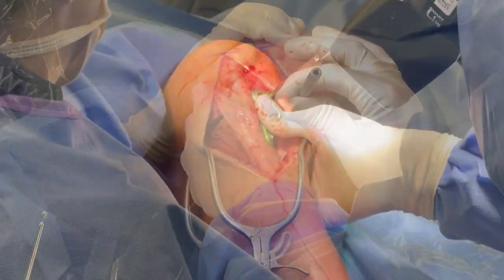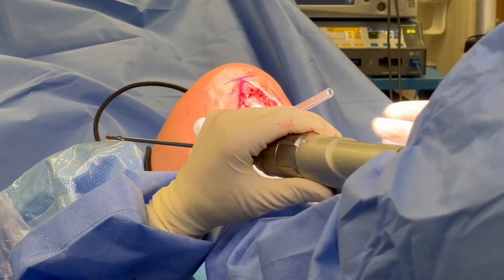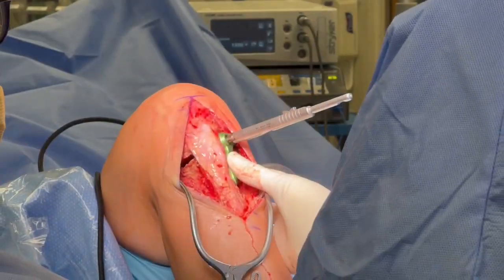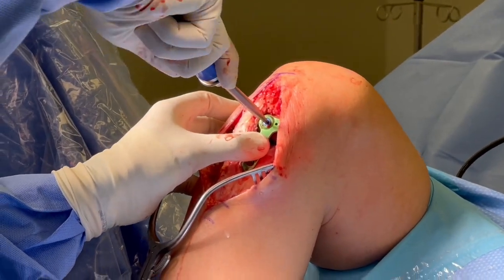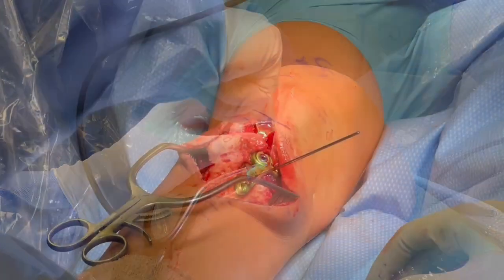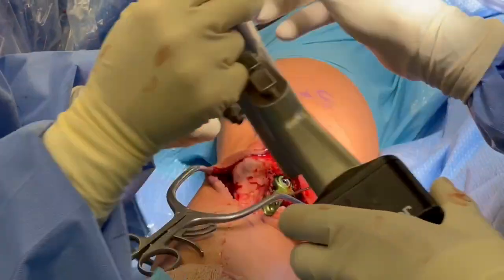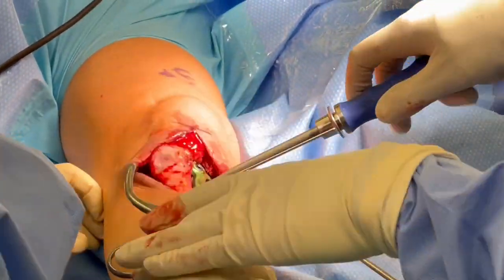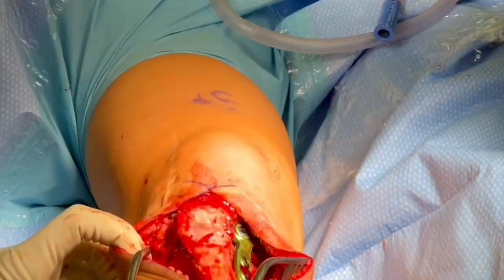We pre-measured 21mm of bone superiorly, so we're able to get this plate on. This is a locking plate; one is a polyaxial screw. We're going to place two locking screws under fluoroscopic guidance, not penetrating out the back and making sure you don't go into the joint space. We're able to get good purchase here, and once we fix these down, we're going to reduce the closing wedge. We place a K-wire to keep it closed, then we're going to use the compression screw — this will be bicortical — and it's going to compress down the fracture site, the closing wedge. Then we're going to place the second locking screw in the plate.